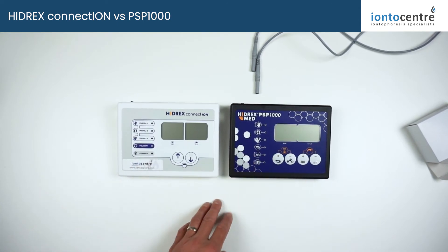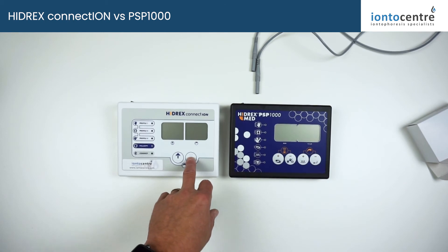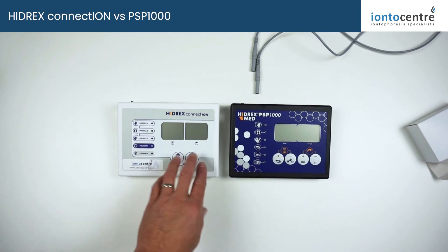You've got your increase and your decrease, your power, and you can also switch between pulsed and direct current and adjust your strength on your variable pulse currents.